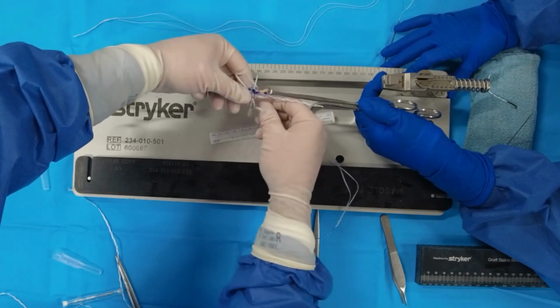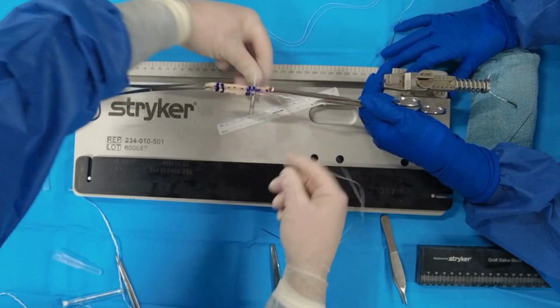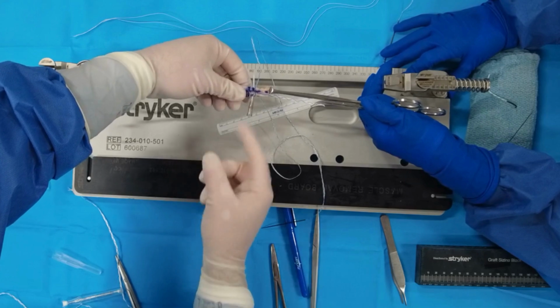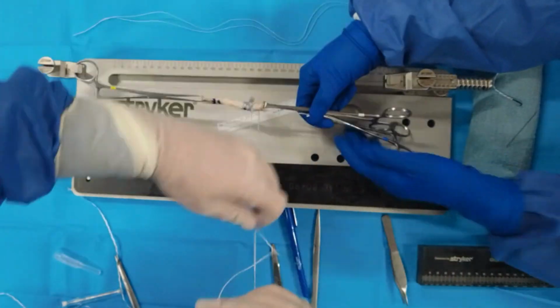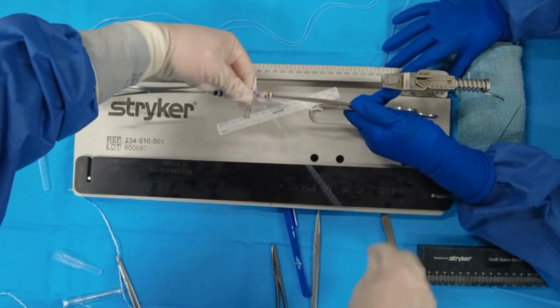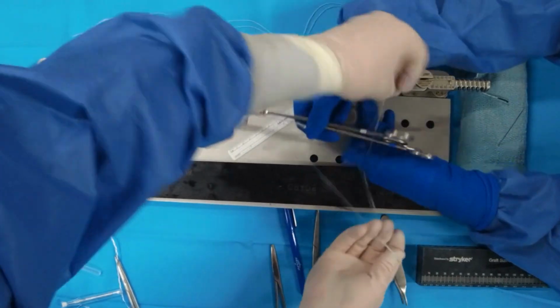And so once I put this and tension it, then it's just a matter of finishing out our throws to get to the end, and we can test our angiocath to make sure that we're still having free movement in that region. Typically we'll probably get about 3 or 4 more passes as we get to the end. Because the fibers run relatively parallel, you'll see that as you get closer to the Alice clamp at the end, it's going to want to try to pull out, which is fine.